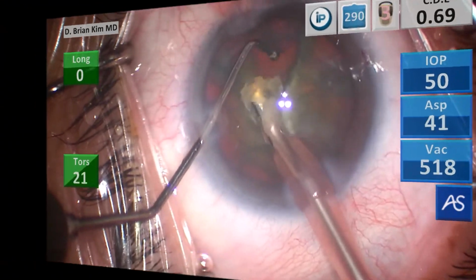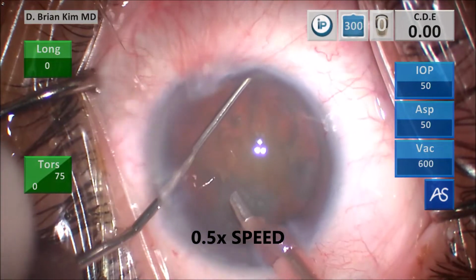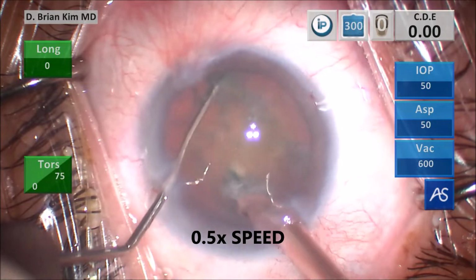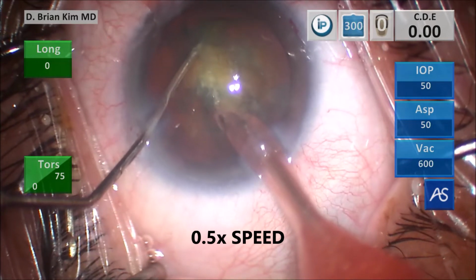So that was, again, in normal speed. This is in half speed. Again, I'm leading off with the chopper tip, getting under the rexis edge, getting to the equator, again, rotating it vertically now, rotating the phaco tip vertically as well. You can see the instruments are brought together. They are directly opposing each other, crushing the lens completely in half.